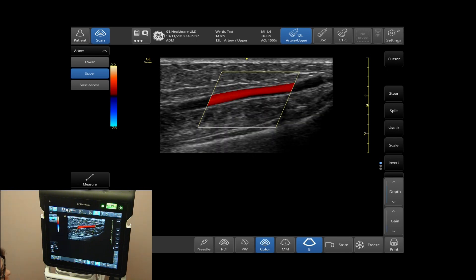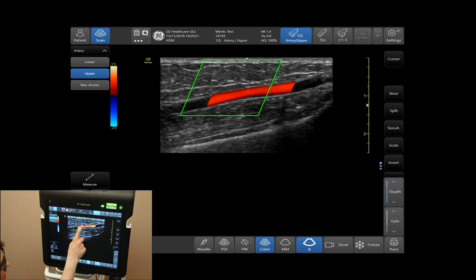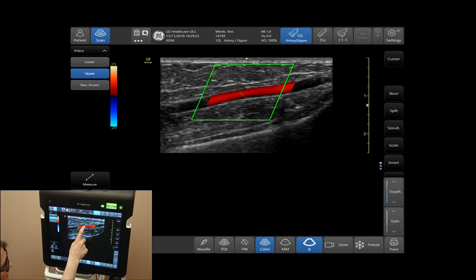To move the color box, tap on the center of the box and move it around your screen as needed.